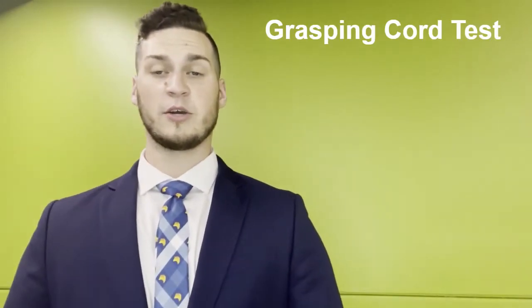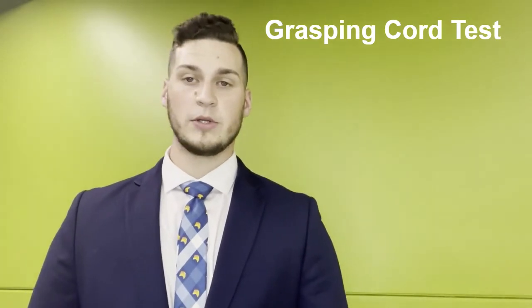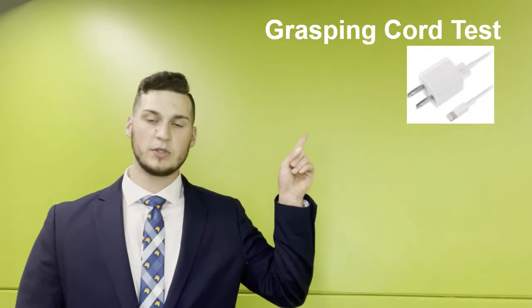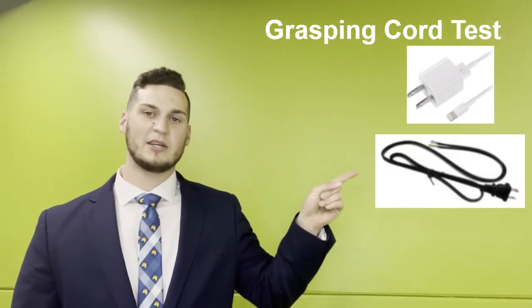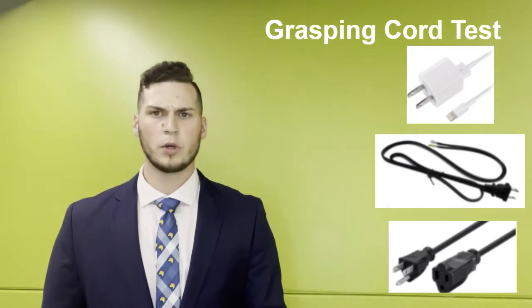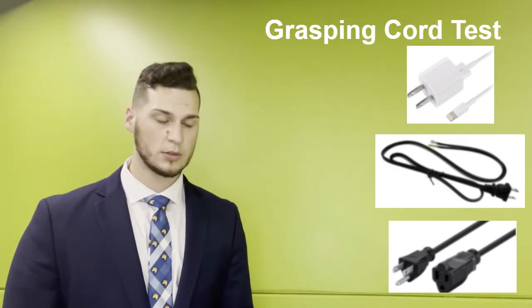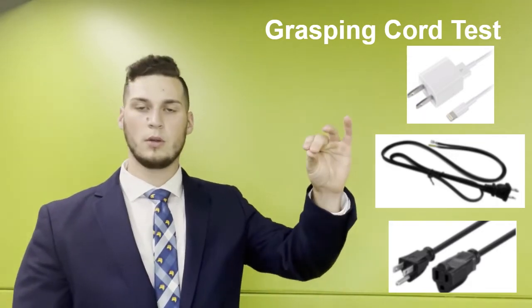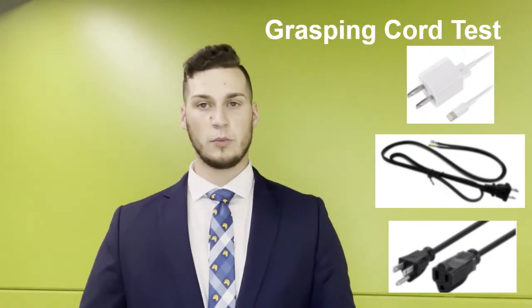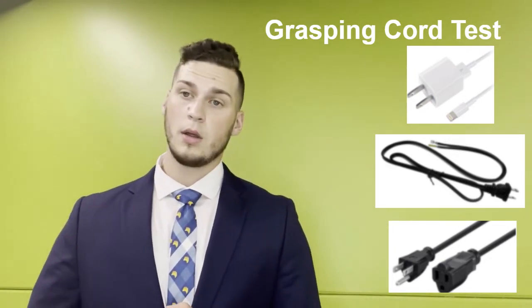I'm going to be going over the grasping cord test for the Jackal Grip 3.1. For this test we're simply asking Eric to be able to grab a cord for 10 seconds. We're going to mount the Jackal Grip 3.1 on him and use three different cords: a standard iPhone charger, a standard household two-prong charger, and a three-prong extension cord. Each cord will be placed on a table and Eric will use the Jackal Grip 3.1 to grasp and hold it for 10 seconds. For Eric, this is very difficult without assistance, so the 10-second hold is all we need to show the device works.